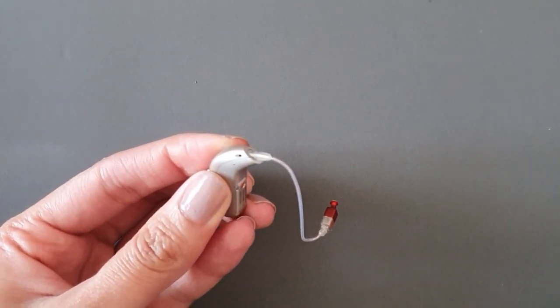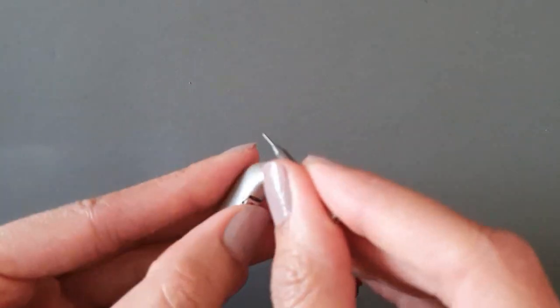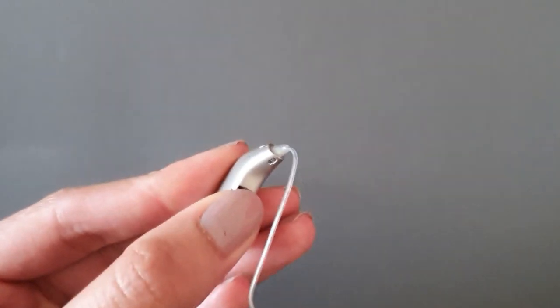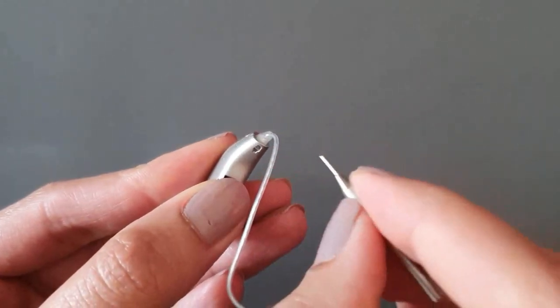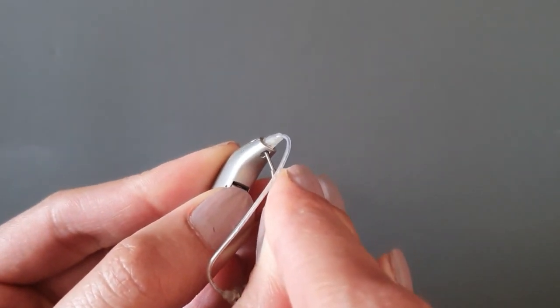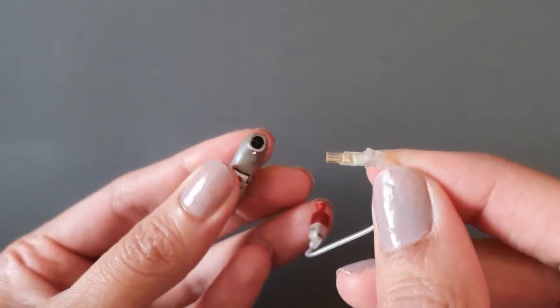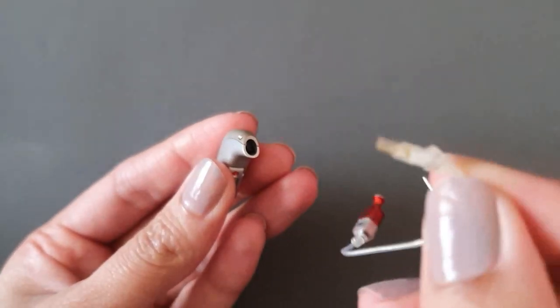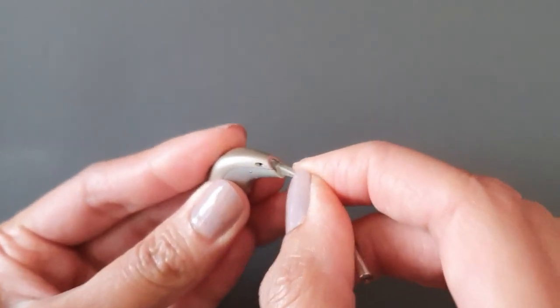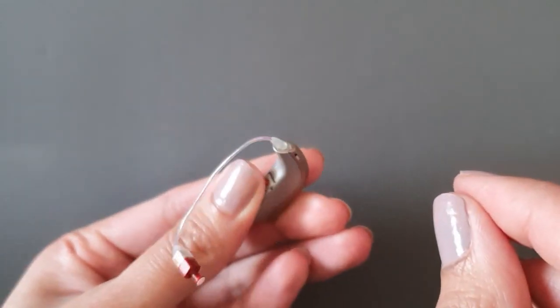Just to repeat one more time: to remove the speaker wire, get your pin and push it in and upwards so you can pull out the speaker wire. Then with your new speaker wire, clip it in all the way. Once it's in and you give it a tug, it shouldn't come away.